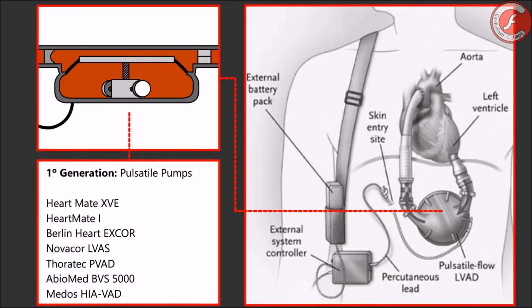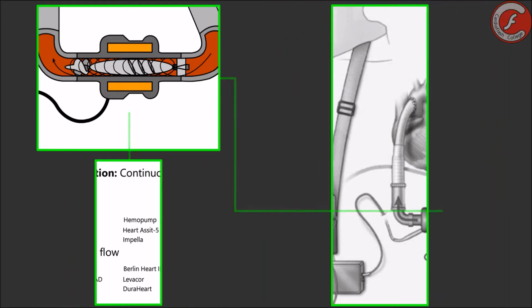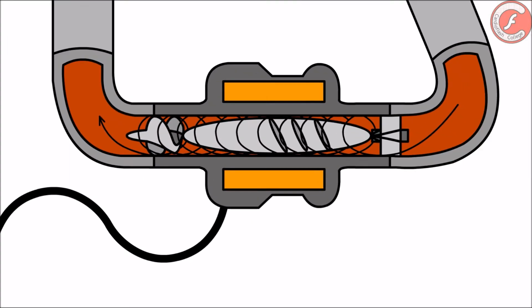Very simple. Because pulsatile flow devices are technologically more complex and vulnerable to mechanical wear, which clinically translates into a higher rate of device replacement and, in parallel, in an increase of mortality and cardiovascular complications. However, despite the fact that continuous flow LVADs are simpler and safer, they are not without complications, since, for example, their use in children is associated with distal vascular underdevelopment and a lower probability of recovery of ventricular function compared to pulsatile flow devices. In any case, continuous flow LVADs are the most used today.